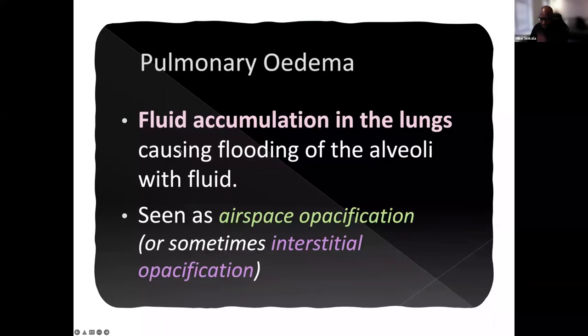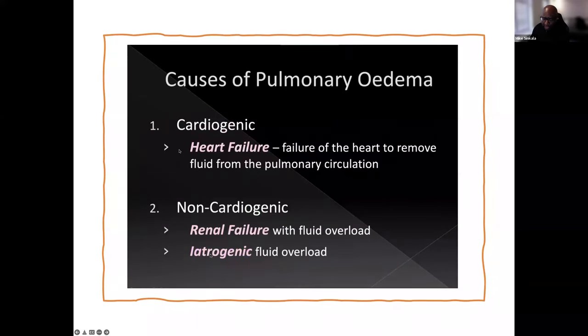What are the causes of pulmonary edema? There could be cardiogenic causes, maybe because the patient has heart failure, or non-cardiogenic causes like renal failure or iatrogenic fluid overload. Clinicians would want to see exactly what could be causing pulmonary edema, and these requests are quite common, to query pulmonary edema. I will show you how it looks on a chest x-ray anyway.